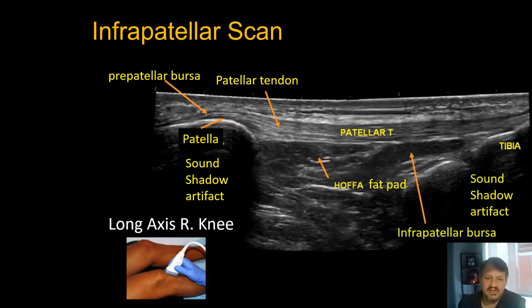The infrapatellar bursa shows a little posterior acoustic enhancement as a result of fluid within it. Remember fluid is compressible like fat pad, but the posterior acoustic enhancement is a telltale sign. Unlike anisotropy, this fluid artifact will not go away when you change the probe angle.